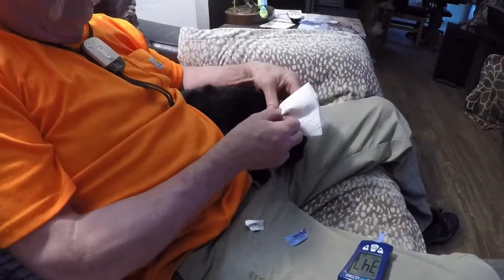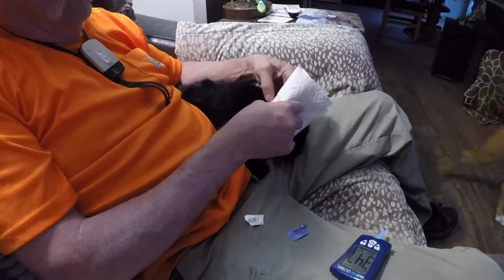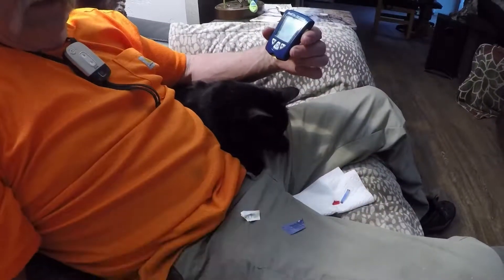Take a little paper towel and rub it on there. He's ready for his two units of insulin. Just remove the strip and you're done.